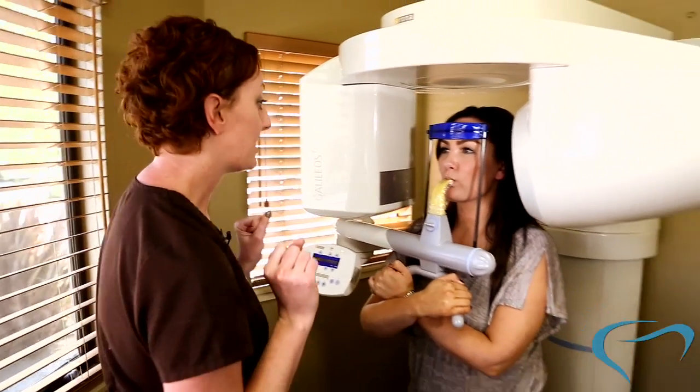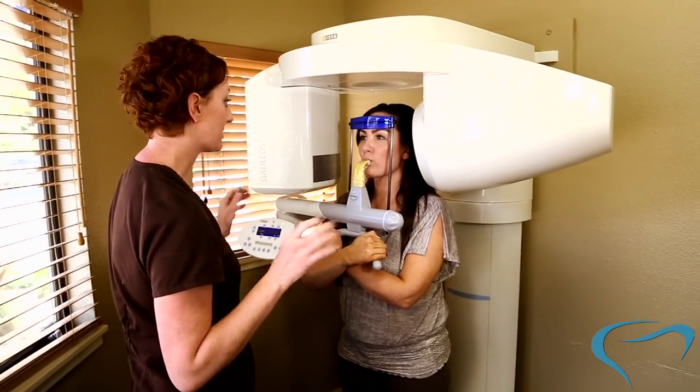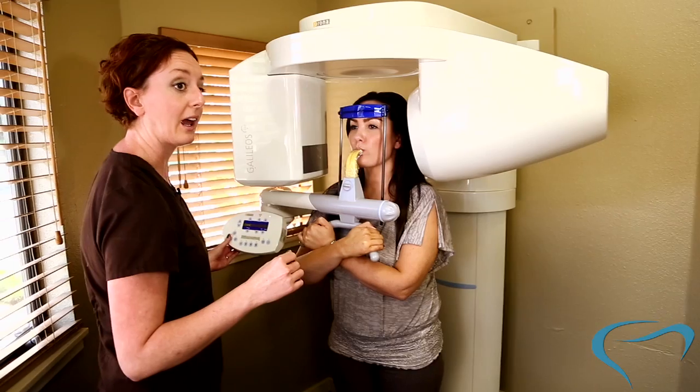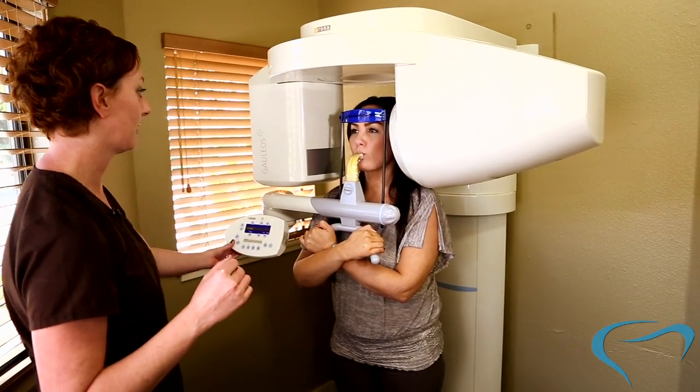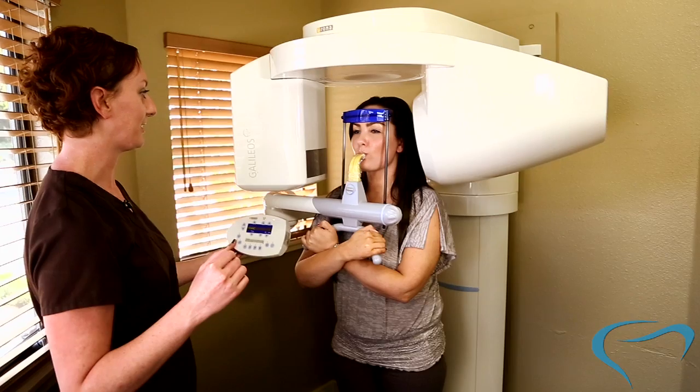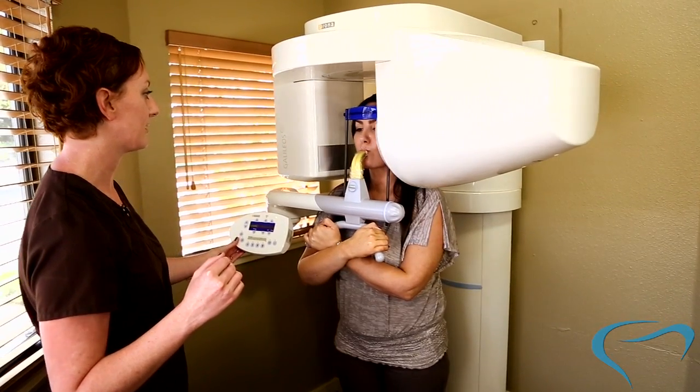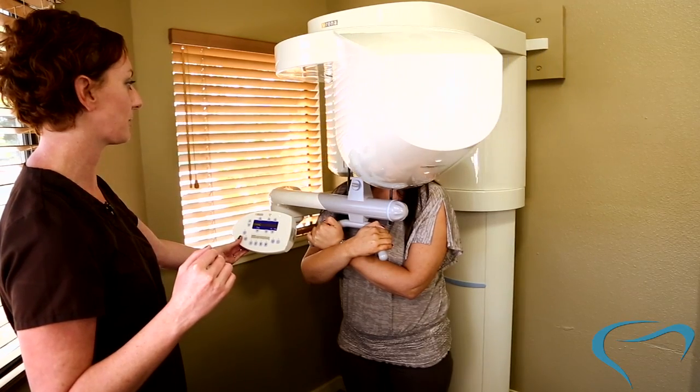About 10 to 15 seconds, I just want you to stay as still as you can, okay? You're doing a really good job. All right, and here we go. Perfect. Doing really good. Great. Stay right there. That looks real good.